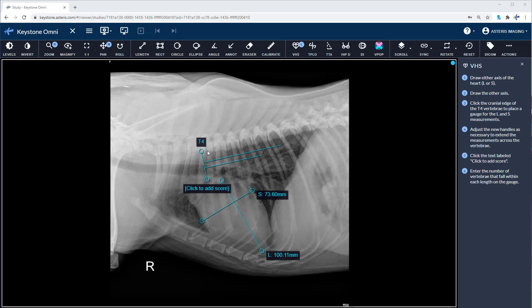Count the vertebrae within the long axis — six. You can also count within the short axis if needed, but Keystone will do the calculation for you.